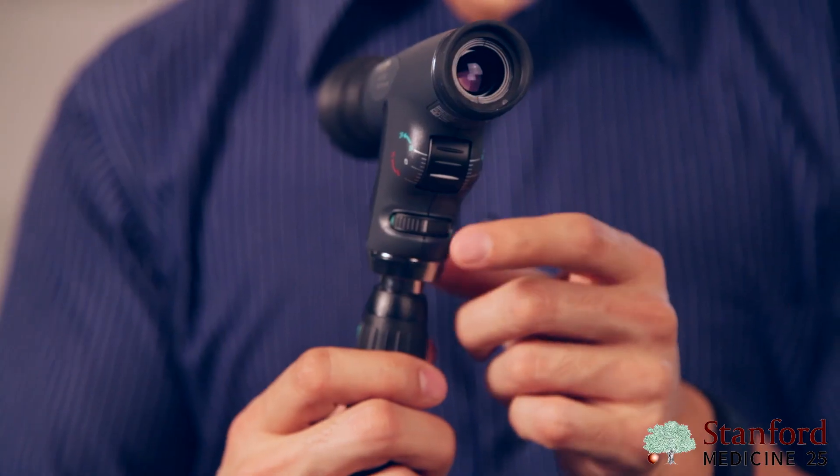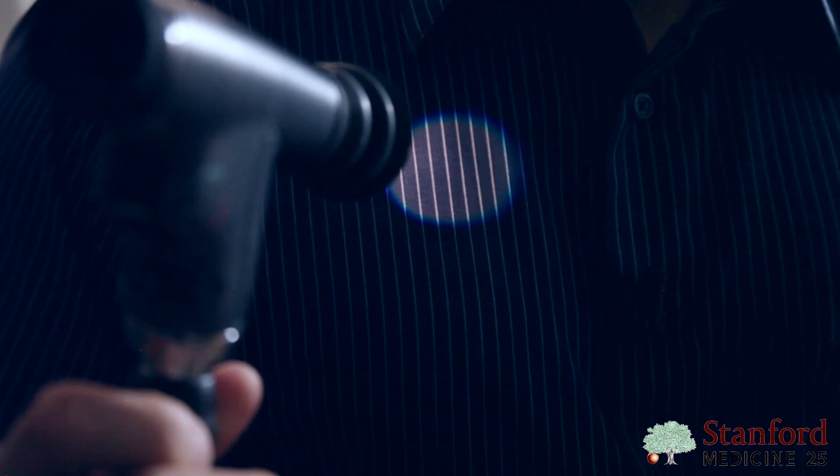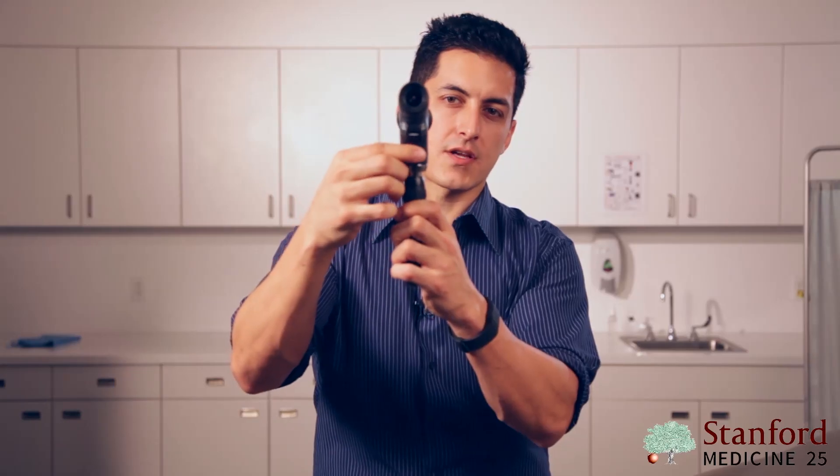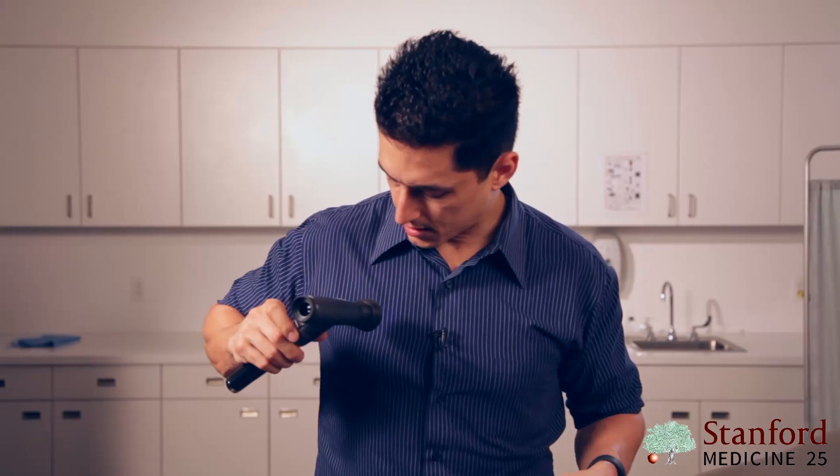The second thing to know about the ophthalmoscope is this carousel setting, which allows you to change the different types of light coming out of the scope. The green line provides a medium-sized circle, which is what I recommend most people use. Sliding the green line left or right gives you varying sizes. You'll also see a tiny slit lamp to look for variations in contour, a blue cobalt filter to look at corneal abrasions with fluorescein dye, and a green red-free filter to see better contrast on the red blood vessels in the back of the retina.